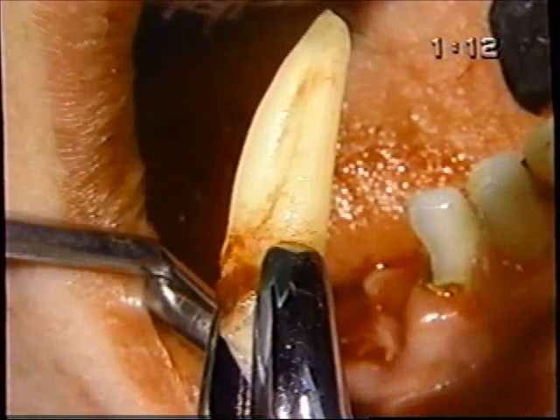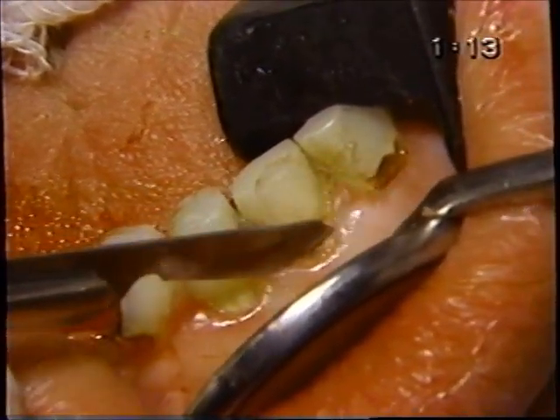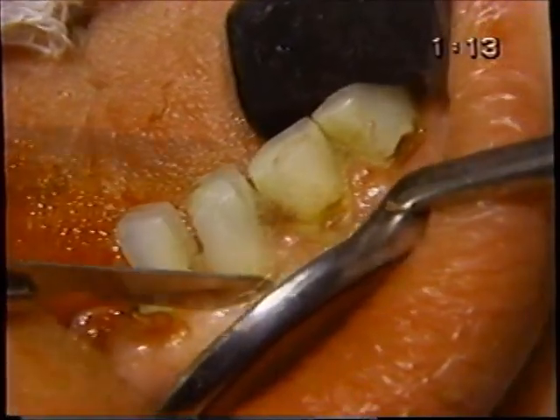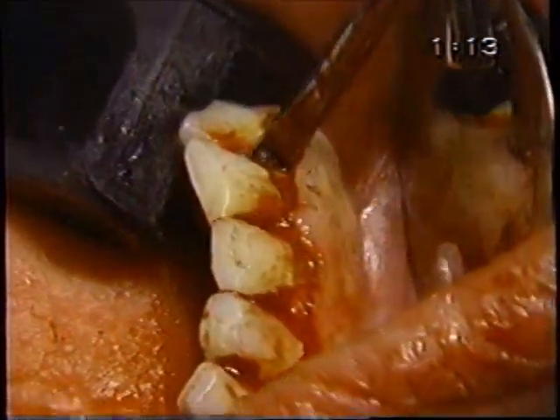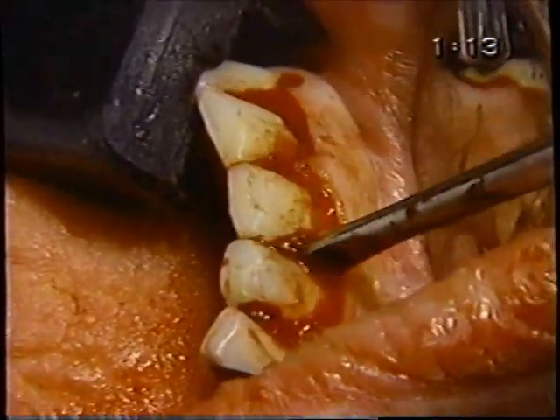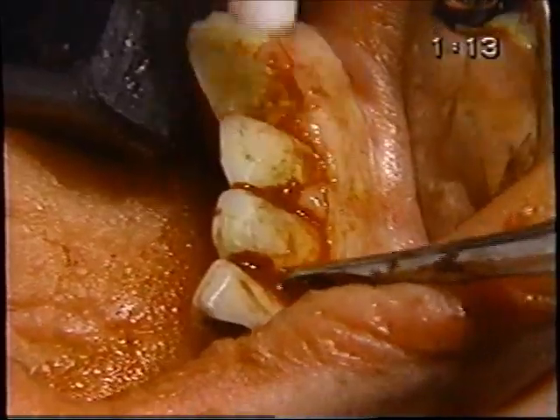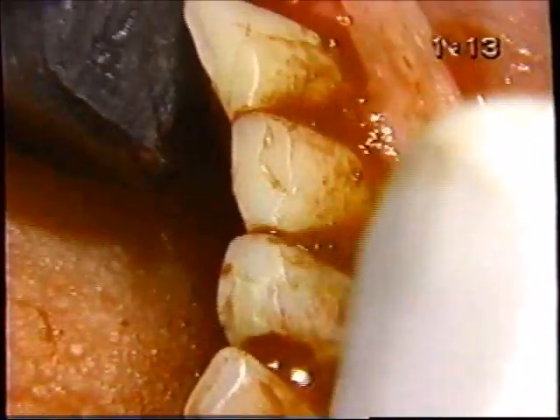It was rotation, slight buccal lingual. See, actually two roots fused together there. And then we'll go to another segment up to the bite block. Again, the papillae and on the lingual. Luxation of the anteriors of these incisors. Let's use the periosteal elevator here so that when we put the forceps in, it does not compress that tissue that we're leaving.